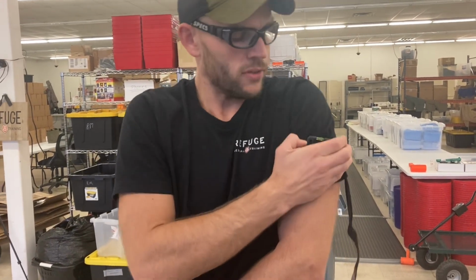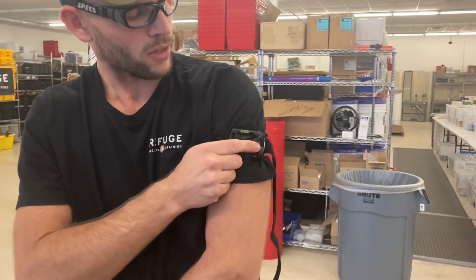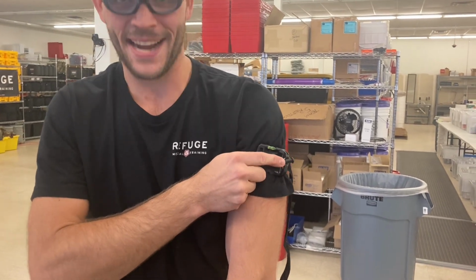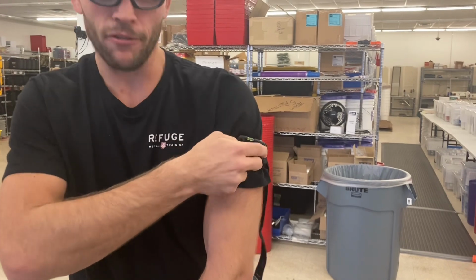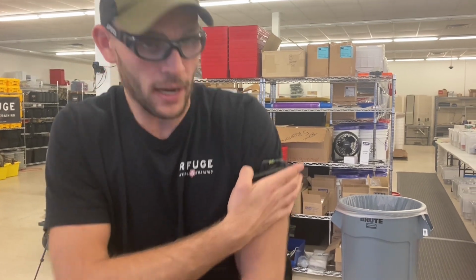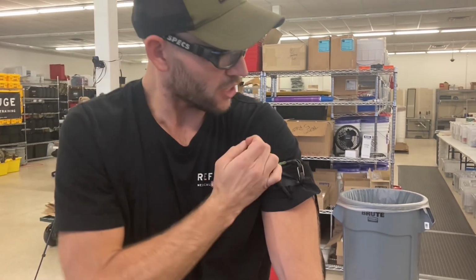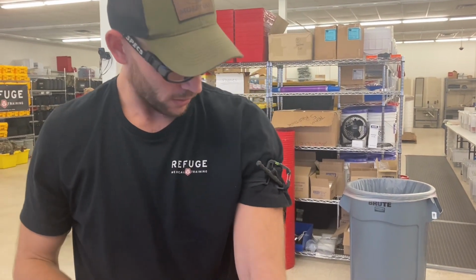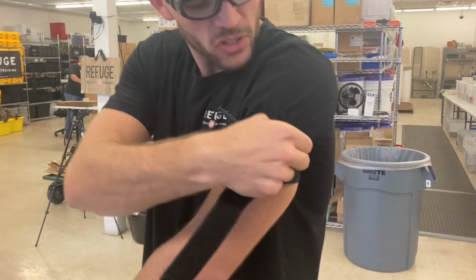Anybody like, okay, sure, that'll work on the right arm. Yep. And you even saw it actually created a problem because if I backed it off one twist, I'm not getting enough arterial compression now, and it accidentally slipped in. And then I had to fiddle with it one-handed, again, assuming I'm still bleeding out, and then go one more. And honestly, I could even stand to do one more than that. Yeah, now we're really good. I just didn't love it.